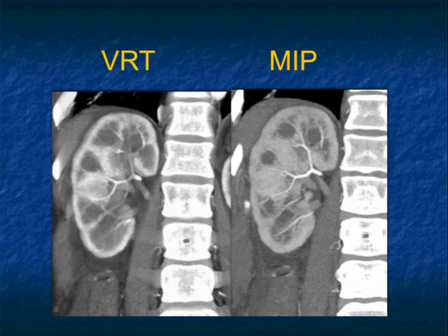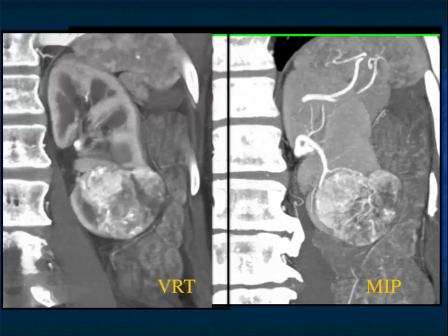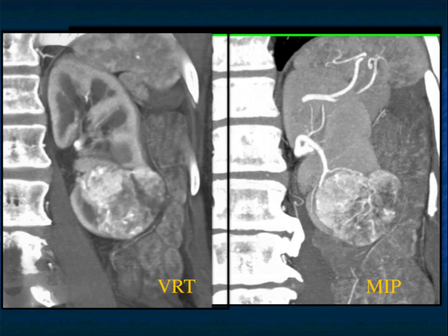Here's a good example of volume rendering and MIP showing the cortical medullary interface and the arterial map. In this case you can see a mass on both volume rendering and MIP — it's very vascular with AV shunting, a clear cell renal cell carcinoma. You also see the branching of the renal arteries to the lower pole and the neovascularity. If you were thinking of doing a partial nephrectomy, you can plan from these images.